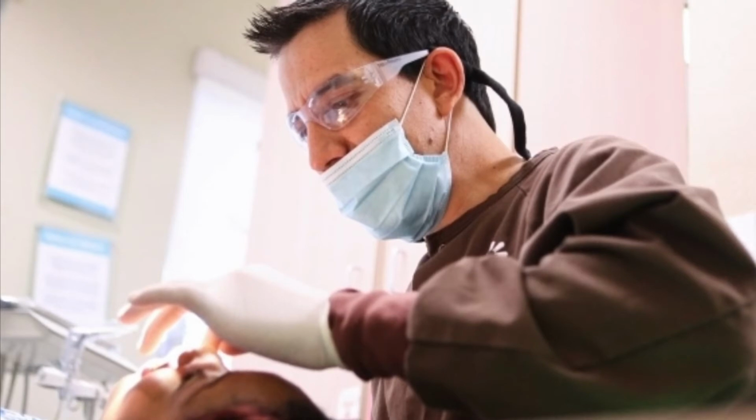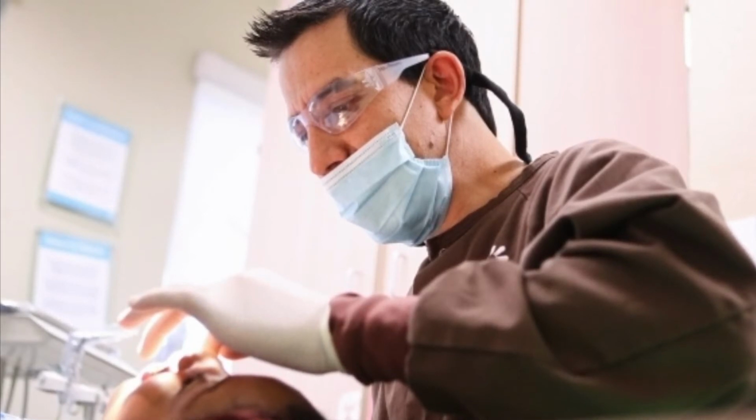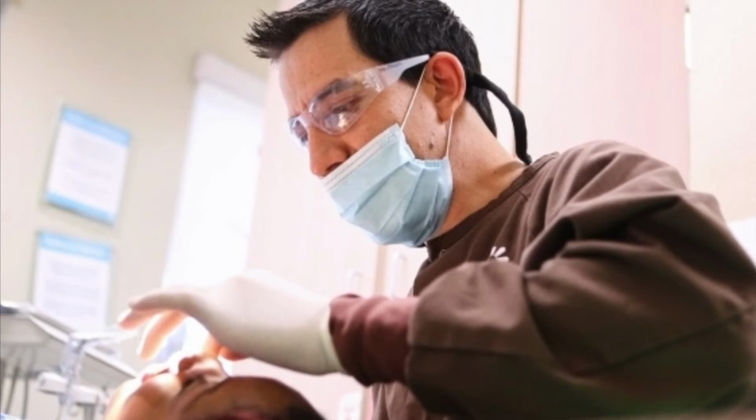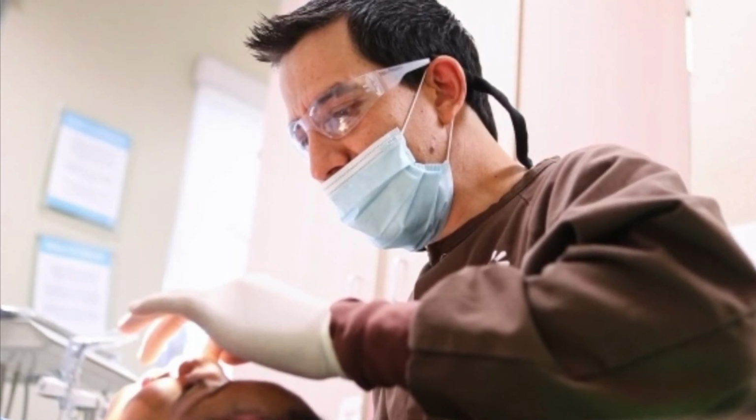The tooth has to be obturated. If we determine the working length, we can do an obturation very clearly and everyone can be happy with the result.